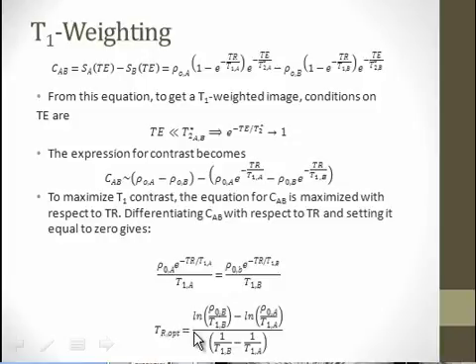Now, of course, you'd have to go through certain steps experimentally to determine what rho naught is, and to determine what T1 is. Sometimes you don't have time to do that in the clinic. Sometimes you can take a guess; from experience, you would know. I'll show you some examples later on. But that's just a basic procedure to get an optimal TR.